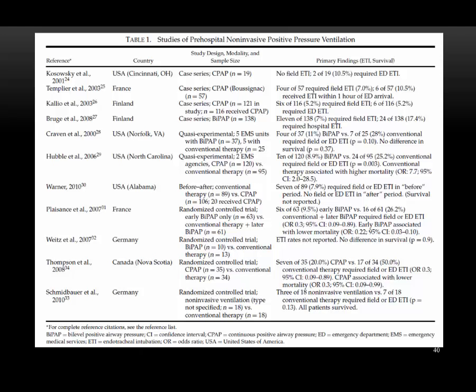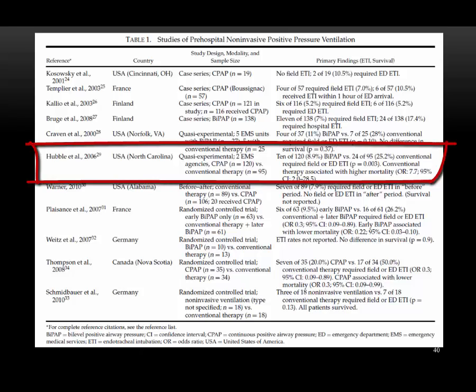Rather than go through each of these slides, let us look at the 2006 Hubble study in North Carolina. The study evaluated the cost-effectiveness of pre-hospital CPAP in acute pulmonary edema. Using data from their 2006 publication, they predicted that 4 out of every 1,000 EMS patients would require CPAP for acute pulmonary edema, resulting in 0.75 lives saved.